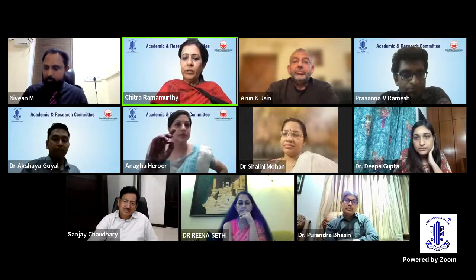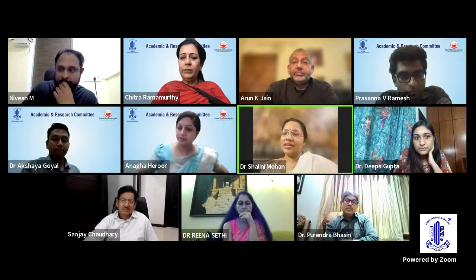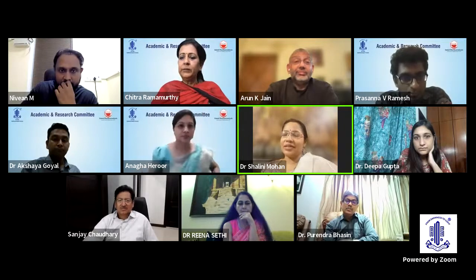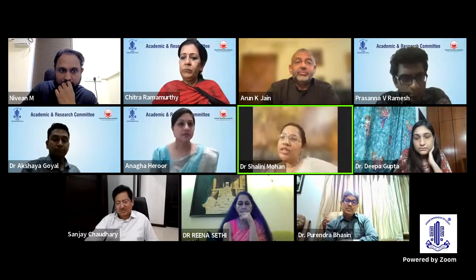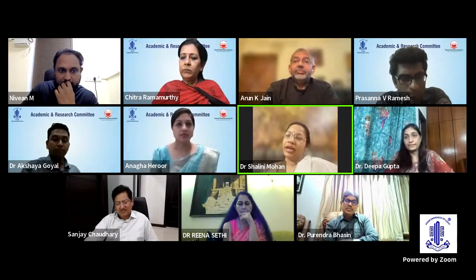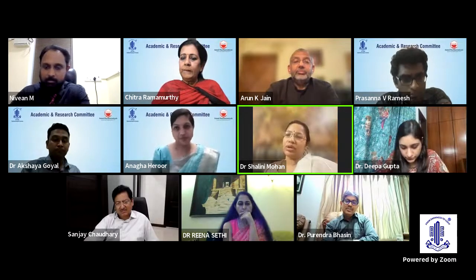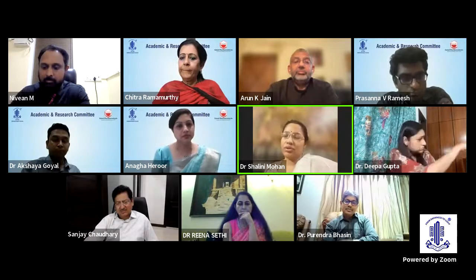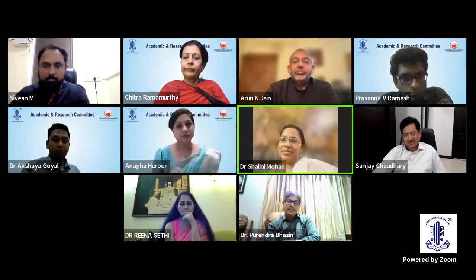Any of you, Dr. Sanjay, Dr. Arun? I would really agree that that was a wonderful surgery. But the one thing I would have done beforehand was making the rexis more circular before proceeding to nucleotomy. So I would have tried to make the remaining rexis more circular, and then would have proceeded with nucleotomy. All the steps he has shown wonderfully well.